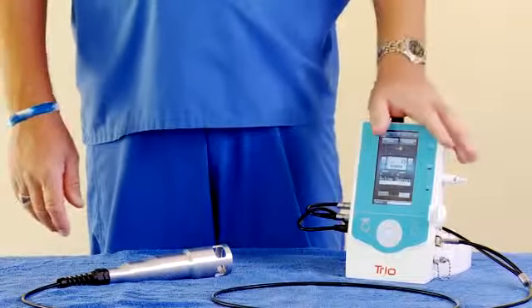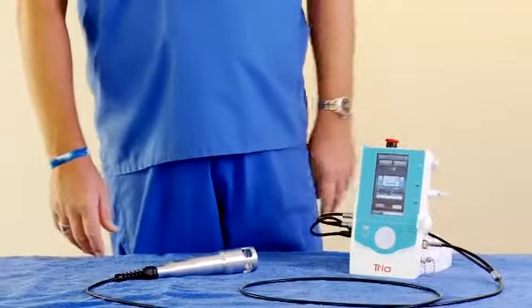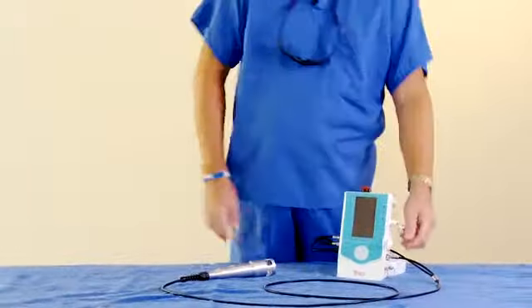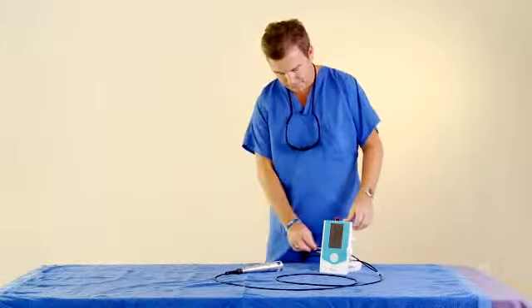To assemble and disassemble the laser, you can look at the manual. It goes over that in detail and step by step. The key to running it is the laser optic fiber has to be very tight. Make sure that it has to be clean.